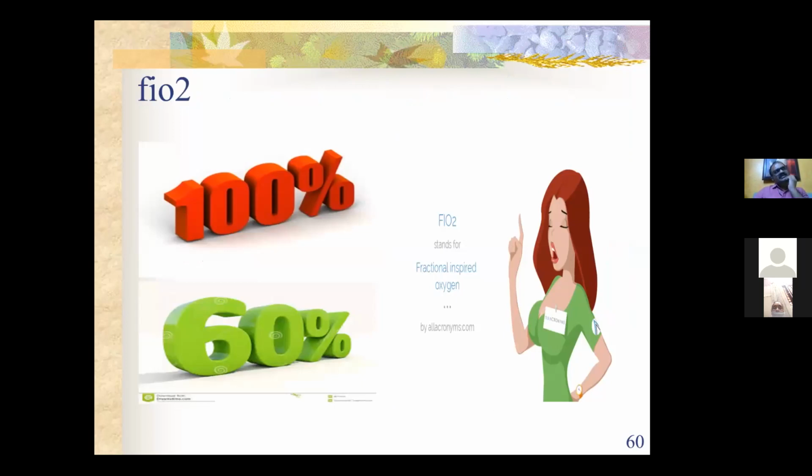We start off with 100%, and try to bring down the FiO2 to 60% or less as early as possible. Otherwise, if you're not able to do it within 6 hours, in the case of ARDS, then it's time for a prone or changing the other parameters also, like PEEP, because oxygenation basically depends upon FiO2 and the PEEP values.